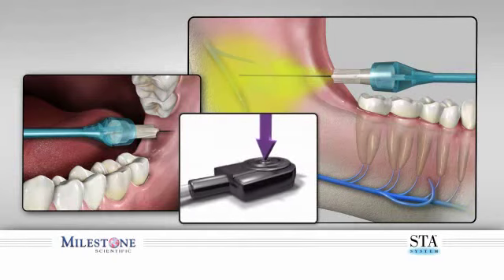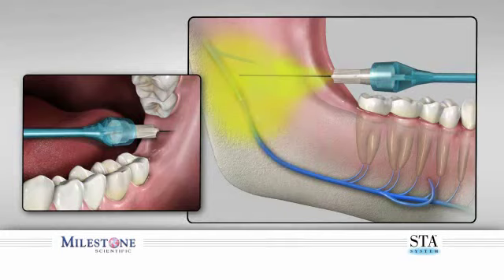The rapid flow rate is used during block injections, only after your patient has acknowledged that they have achieved soft tissue anesthesia of the area being injected. This is acknowledged by subjective statements elicited from your patient. When you have delivered the required dosage, you can remove the needle.